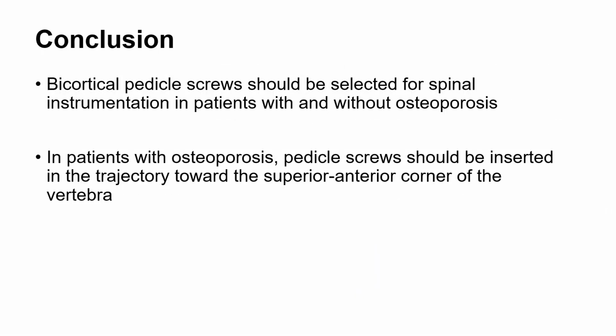In conclusion, our results indicate that bicortical pedicle screws should be selected for spinal instrumentation in patients with and without osteoporosis. In patients with osteoporosis, pedicle screws should be inserted in the trajectory toward the superior anterior corner of the vertebra.